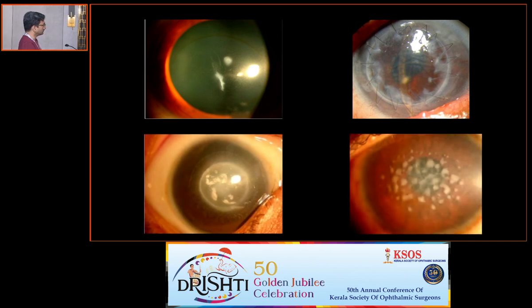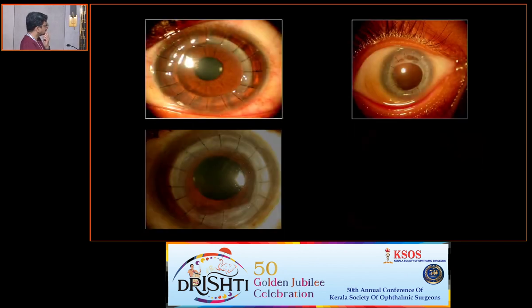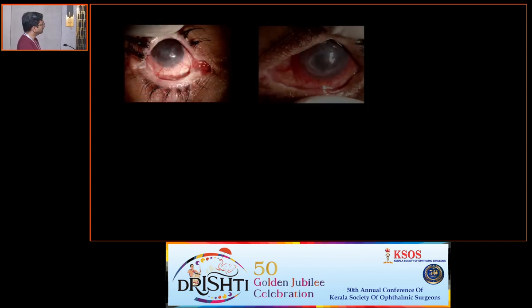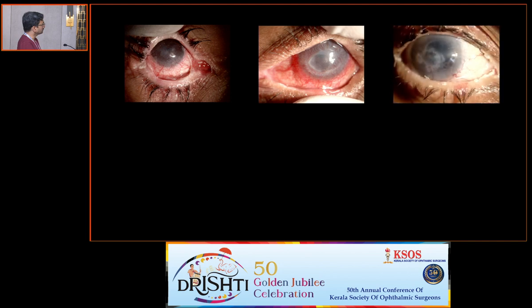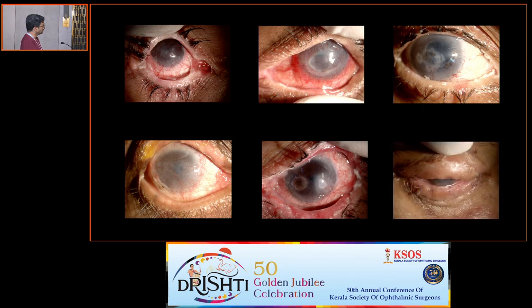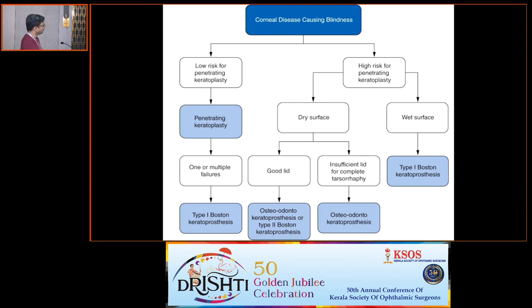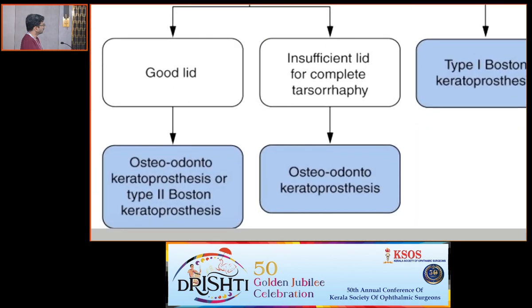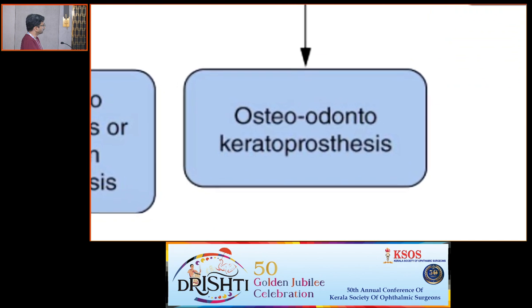When it comes to corneal blindness, corneal transplantation remains the primary sight restoring procedure. However, in patients suffering from bilateral corneal blindness not amenable to conventional penetrating keratoplasty, such as in Stevens-Johnson syndrome, keratoprosthesis is the only viable option. Though different keratoprostheses are available, based on the long-term anatomical and functional outcome, the choice of keratoprosthesis in severe end-stage ocular surface disorder is preferably the modified osteo-odonto-keratoprosthesis, or MOOKP.